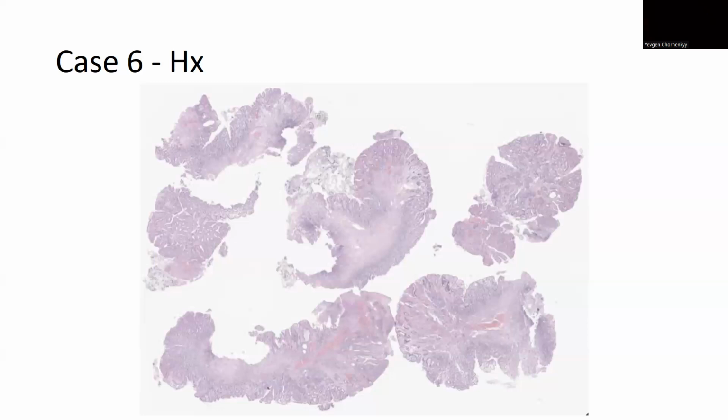Now you can have gastric mucosa in the rectum. What do you call that? That's called the outlet patch. Seriously, it's called outlet patch. So you have an inlet patch and an outlet patch. So you can have various kinds of mucosa distributed through the GI tract, other than metaplastic events.